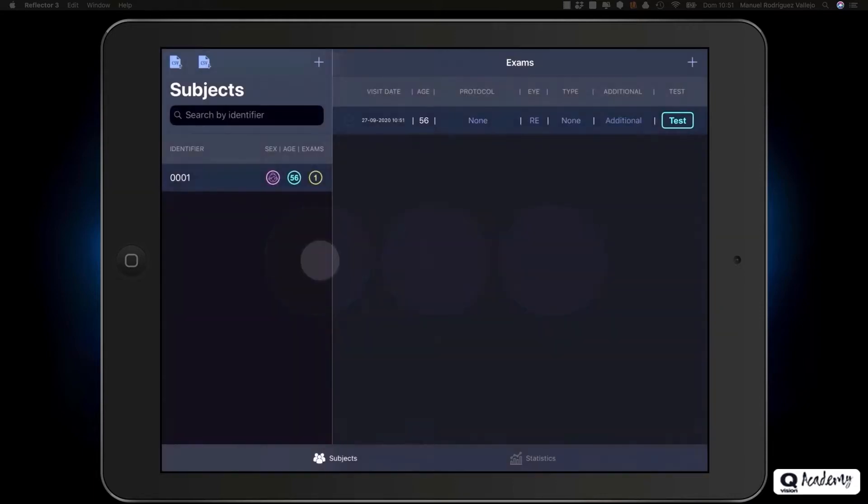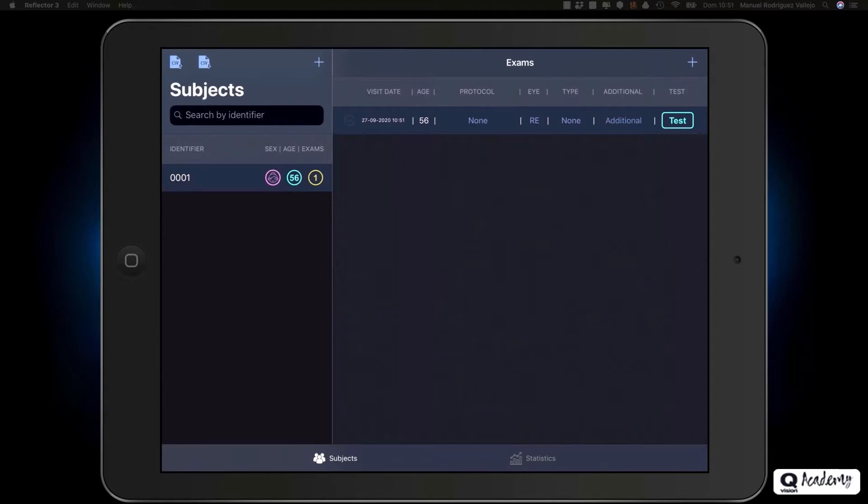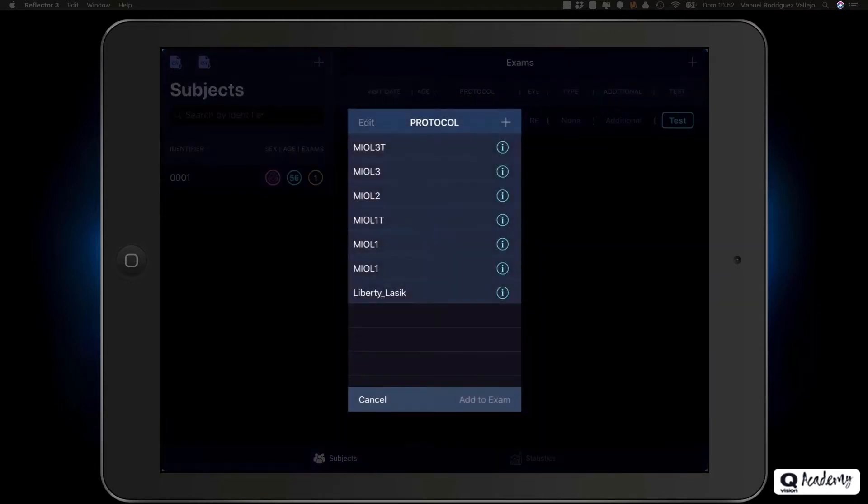The tests must be associated with a protocol. Protocols allow you to create a group of subjects with common characteristics, who are tested under the same measurement conditions. Click on the none button to access the list of protocols.